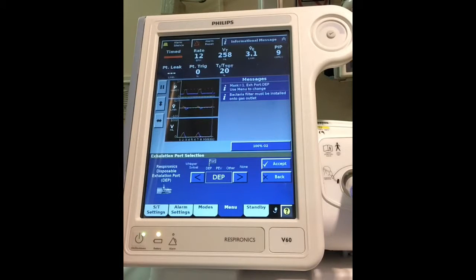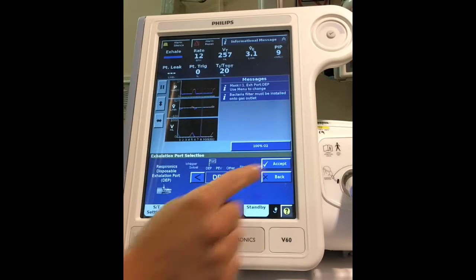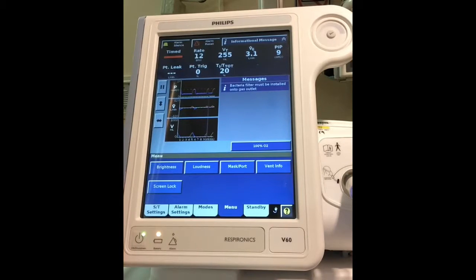Hit accept. Now you're going to be selecting your exhalation port, and we always use the DEP. That's your disposable exhalation port. So hit accept on that.